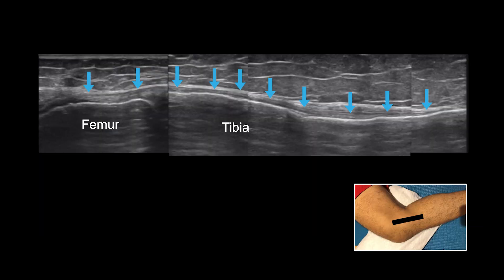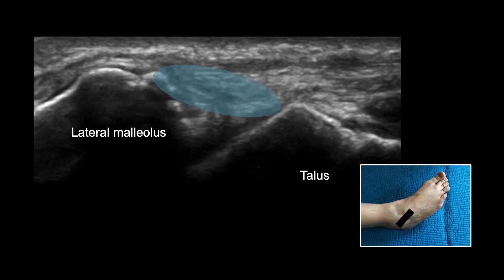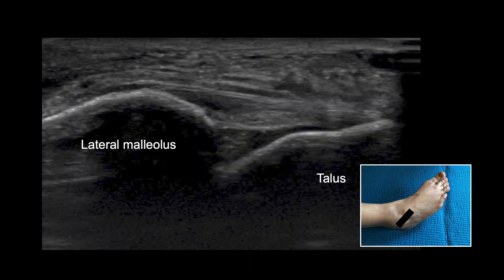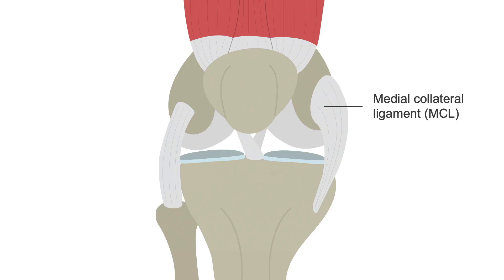This image shows the longitudinal view of a normal medial collateral ligament of the knee. This next image shows non-visualization of the ligament fibers of the anterior talofibular ligament. Also note the bony irregularity of the attachment site on the fibula or lateral malleolus, suggesting an avulsion-type tear. This longitudinal view of the anterior talofibular ligament shows a focal hypoechoic defect closer to the fibular attachment site, suggestive of a grade 2 sprain or partial tear.